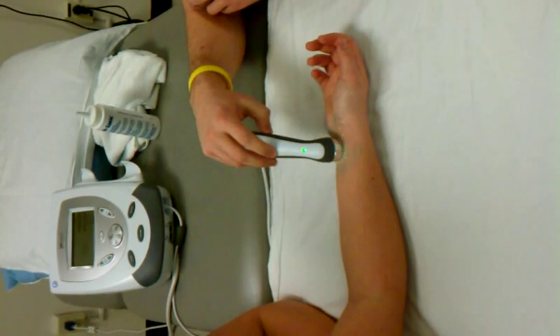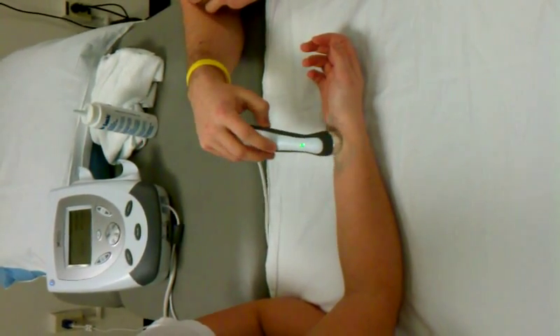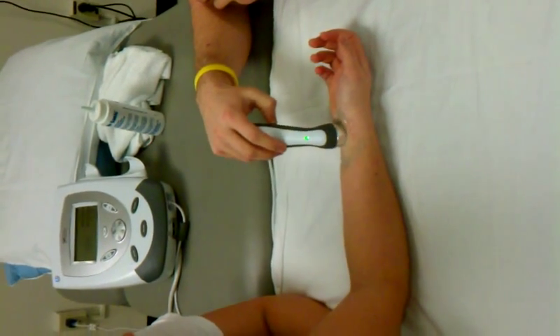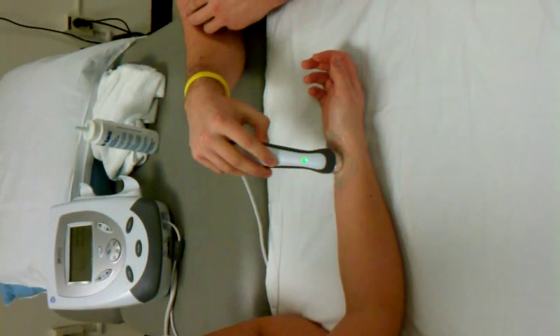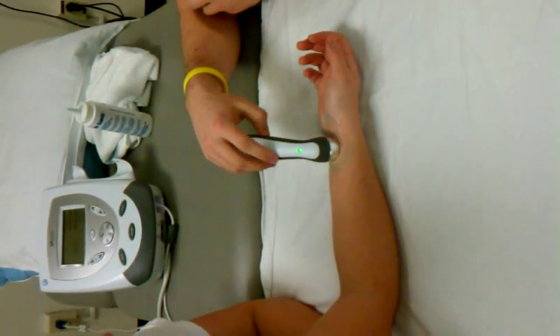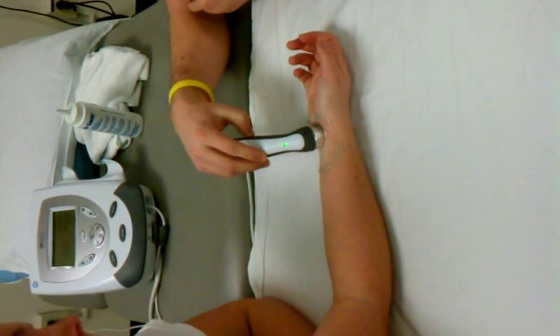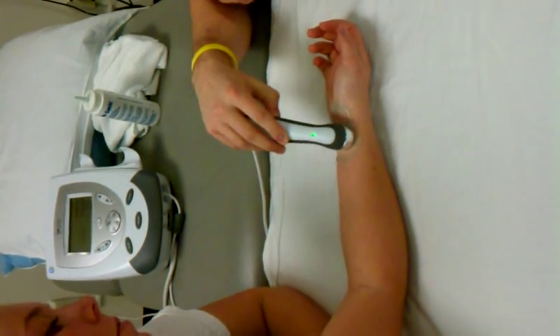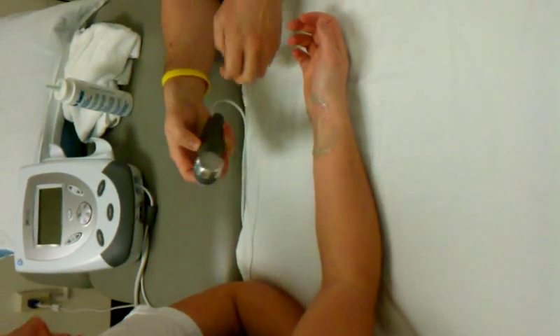Just try to keep good contact with the probe on your skin. Try not to go over two or three times the size of the head — just the area that works best for the machine. All right. That was good time.